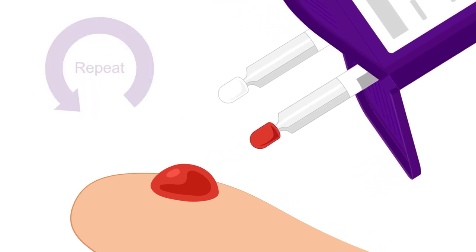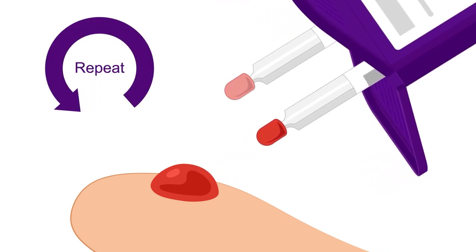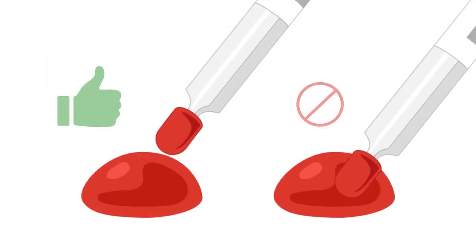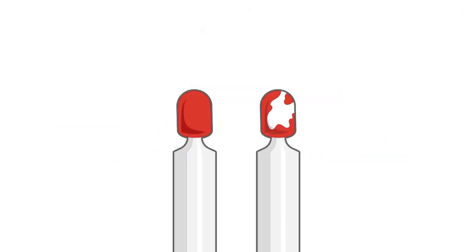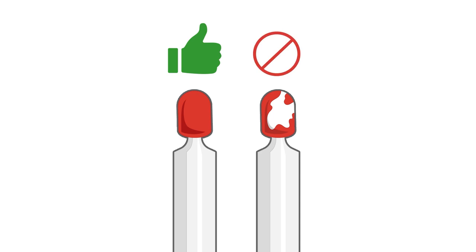Repeat this for all samplers. Avoid oversampling by touching the tip gently to the surface of the blood drop, not submerging it. Make sure the tip is fully red. No white should remain.